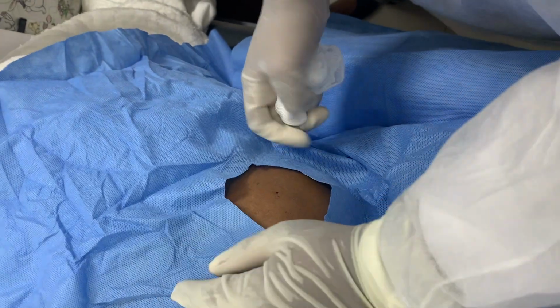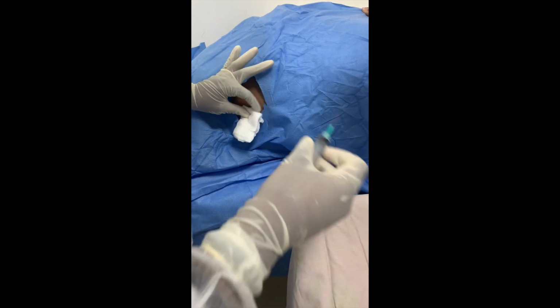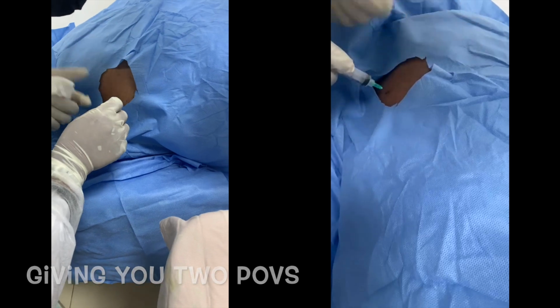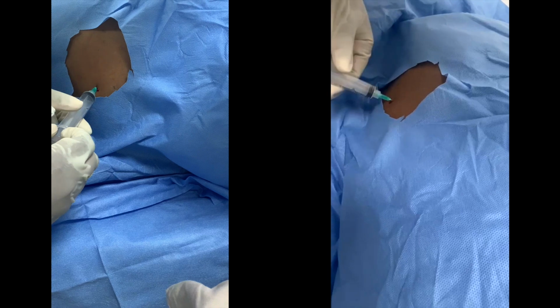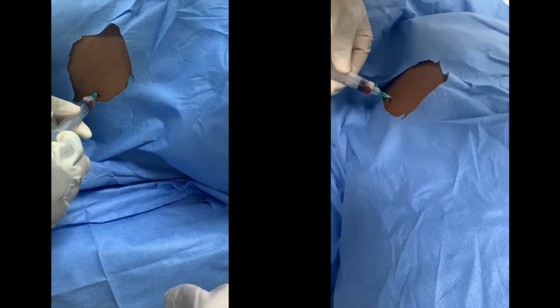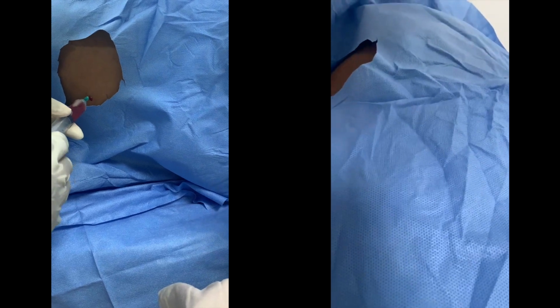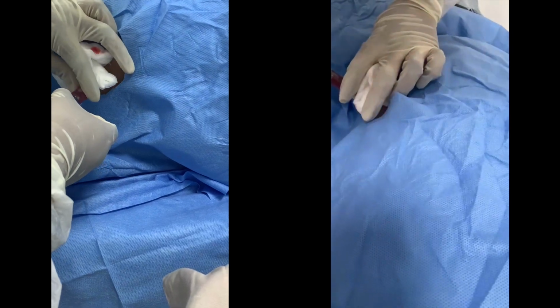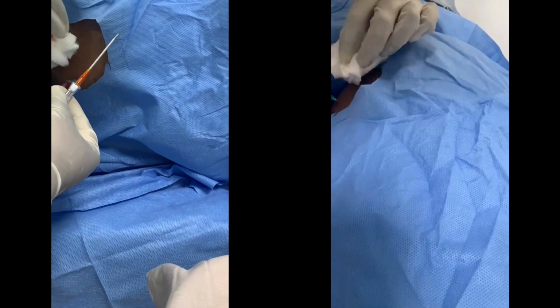Now, according to all the assisting I have done on this procedure and all the videos I had watched to perfect my art before I was pushed into the battlefield, you've already located the points you're using. So using a syringe, I think I used a 10 ml syringe here, and a needle, you have to go perpendicular into the abdominal cavity. You have to go straight down. It's kind of a guide wire, so to speak, for you to locate where the fluid is and how you're going to be tapping it.